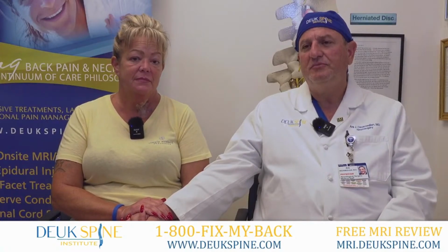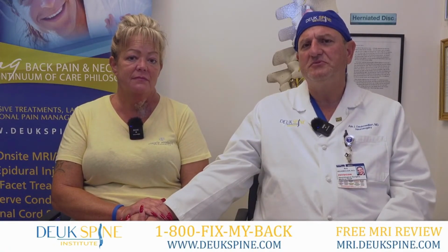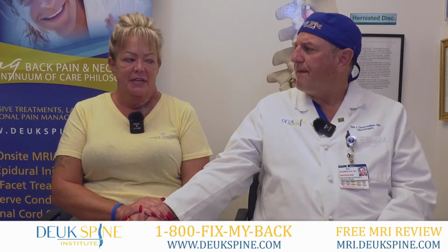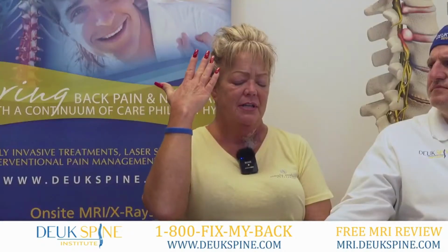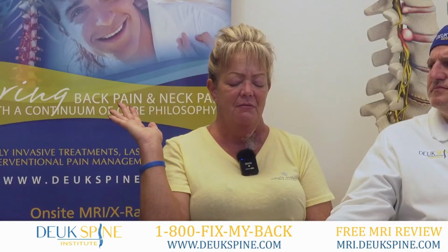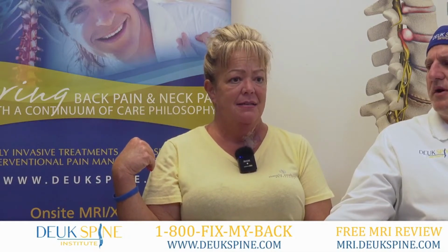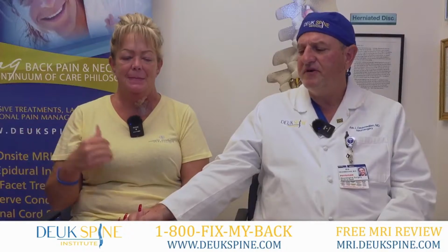You also had the Deuk plasma rhizotomy, I just remembered, because she had facet joint pain as well as the disc problem. And she was having pain turning her head to the right, weren't you? Oh yeah, I was having extreme pain. I could hardly turn to my right. It was going down into my right arm extremely bad. And that's gone. Yes. Amen. And it's gone permanently. So I'm very happy for you.